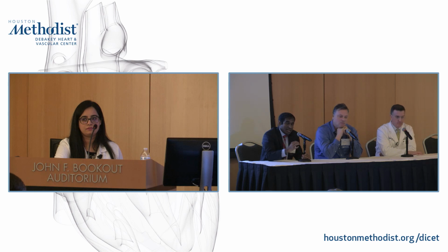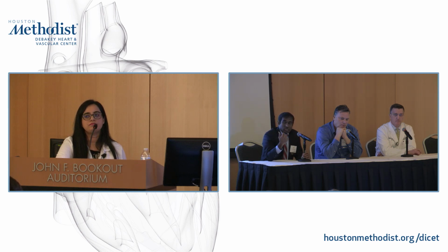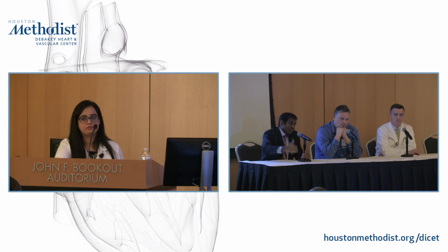The only editorial I'd add to that statement, which is very fresh off the press that Barry shared yesterday, is there are two devices for support, IMPELLA right side support and then PROTEK Duo. IMPELLA right side support, FDA just put out a letter saying it was approved as a humanitarian use because there was no right-sided support, but they put out a letter saying that of the reported events right now, the mortality has been much higher in patients who have RP. Now, is it patient selection or not? I don't know. And then you bring up these logistic questions, which are very relevant.